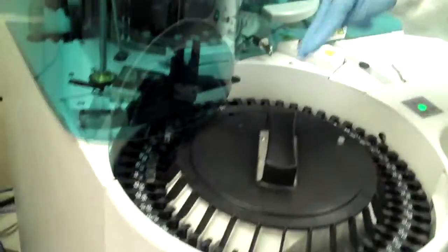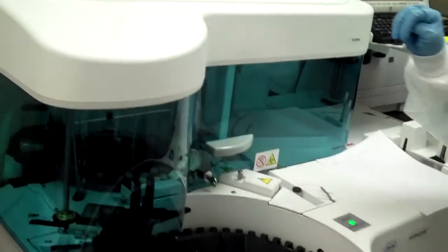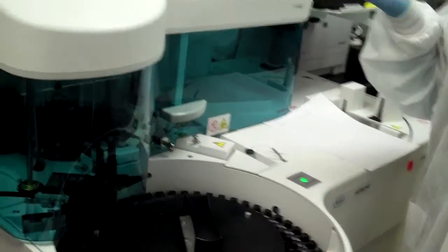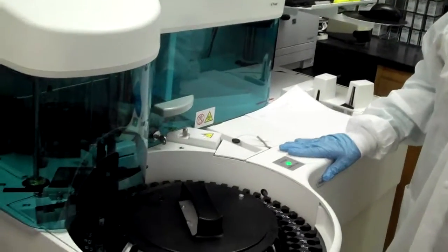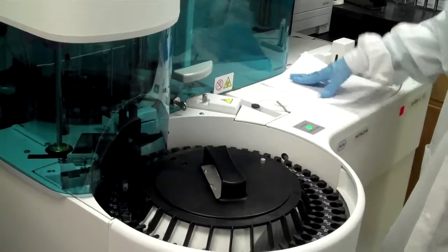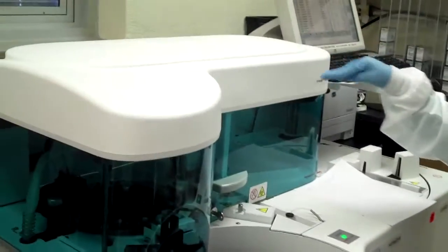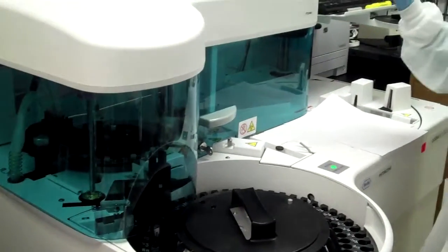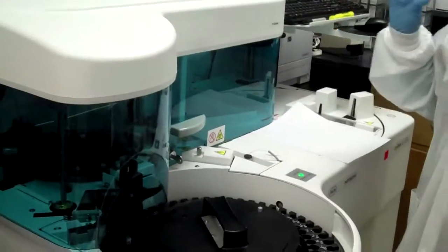The probes will come over, pick up the sample, put it into a cuvette, come and get the reagent that it needs, mix it with the sample, and keep it all at 37 degrees, which simulates body temperature. That's where most of the reactions happen. The reagents, it keeps refrigerated so that they stay nice and stable, but at intervals that only it knows about, everything's just precisely timed. It knows when to mix, when to stir, when to incubate, when to read.